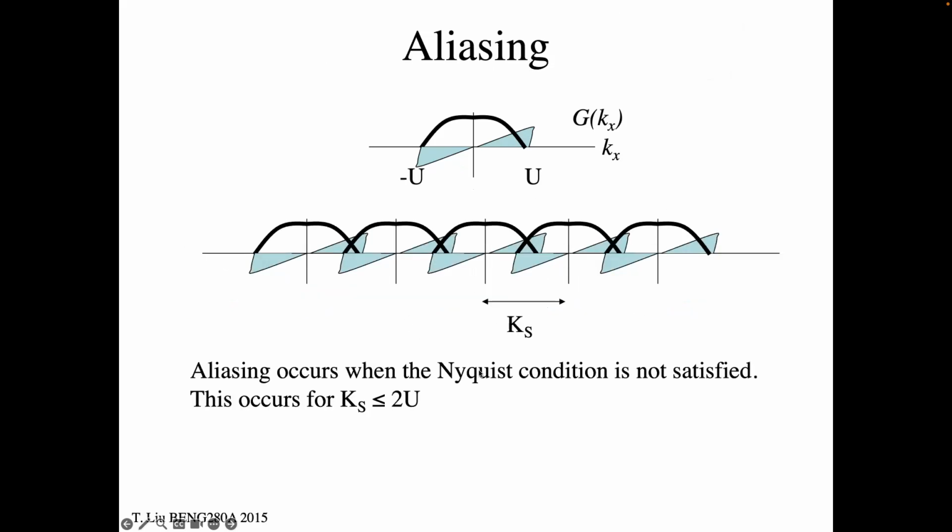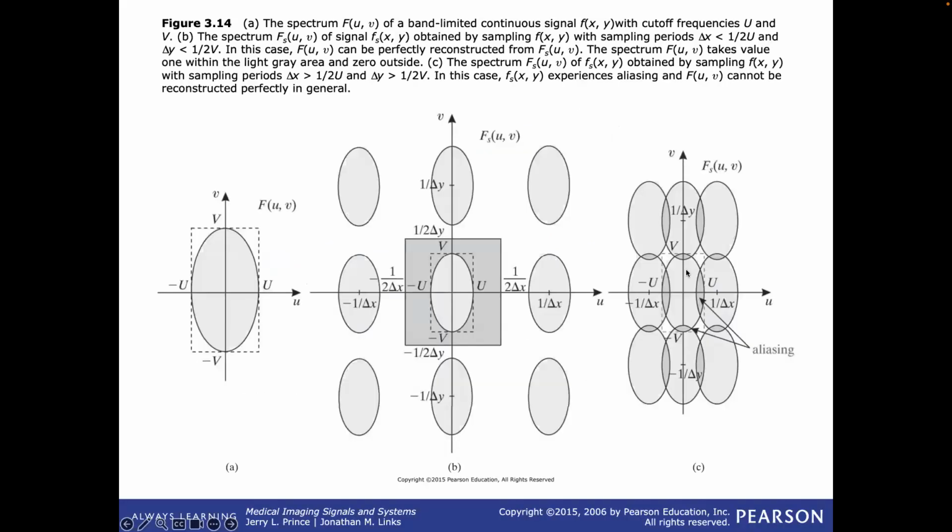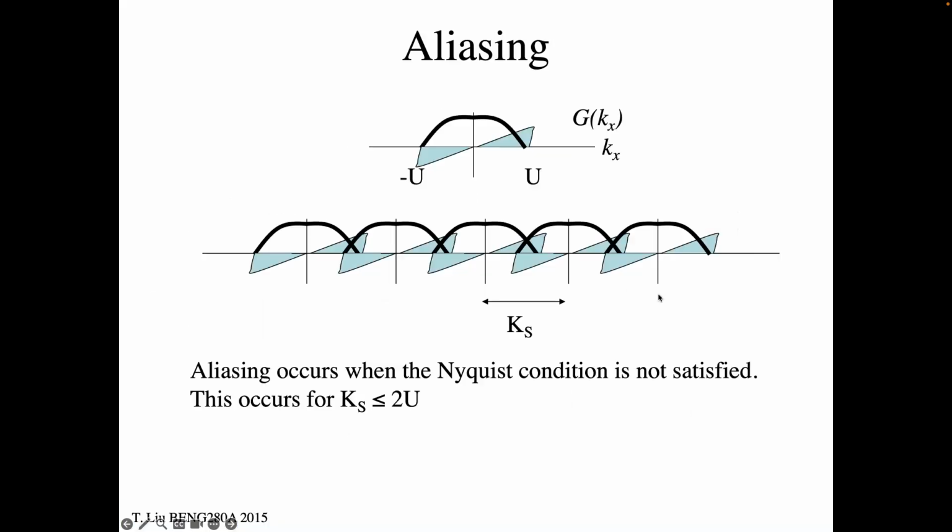Okay. If that isn't the case, then the replicants start getting closer and closer together, and you start seeing some very interesting phenomena in your Fourier transform where those overlaps are significant, right? It doesn't look like the right Fourier transform. You haven't sampled high enough. So if this is the case and you're seeing the Fourier transform of your function and it looks really terrible, what's your first thing?